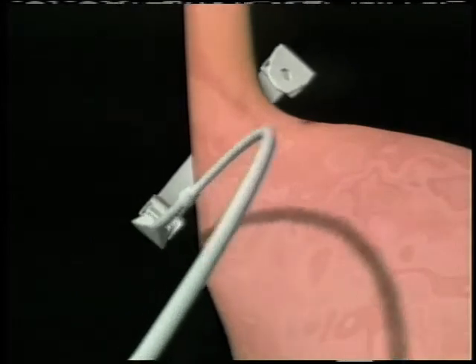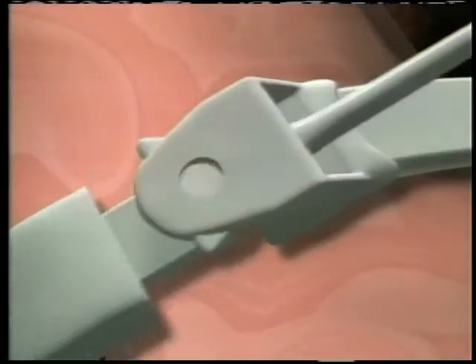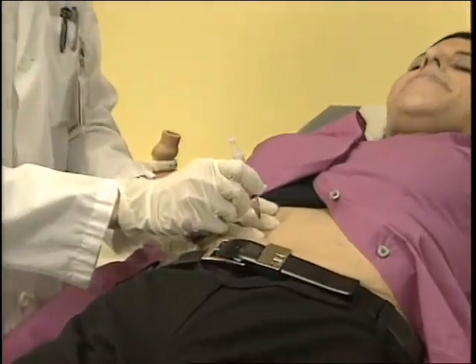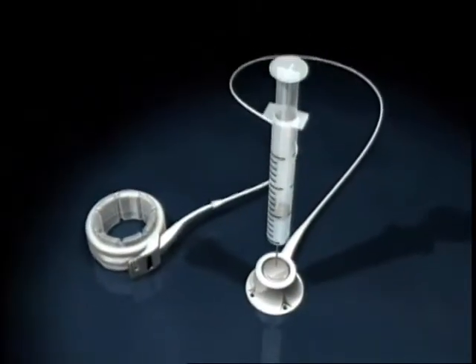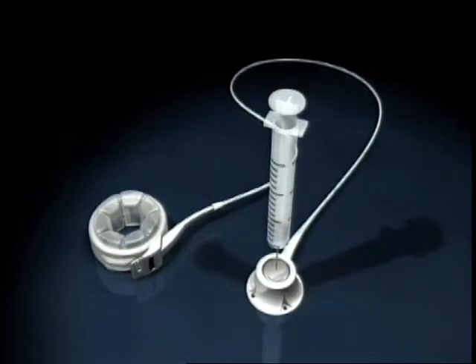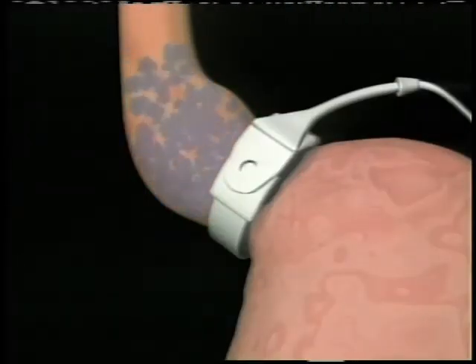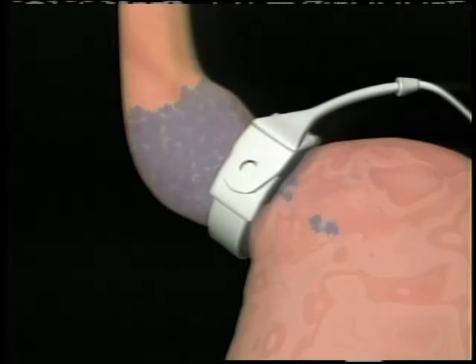The lap band is introduced into the abdominal cavity and then placed around the very top of the stomach, secured into place, and then attached to a little well which sits underneath the skin. It's through that little well that in the office your doctor can adjust the band and make it slightly tighter and a little snugger, so that it facilitates a better sense of fullness, a decrease in appetite, and overall less food is being consumed.